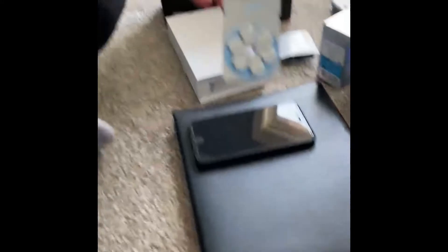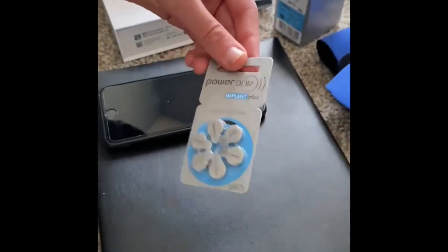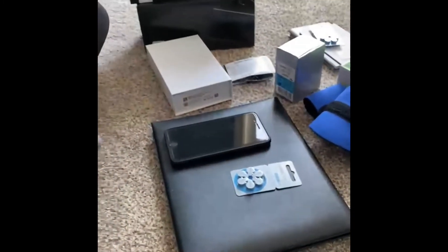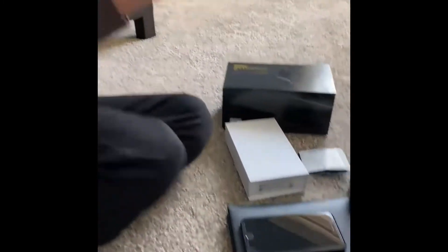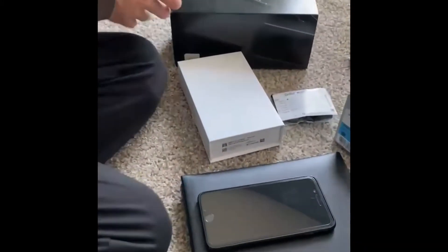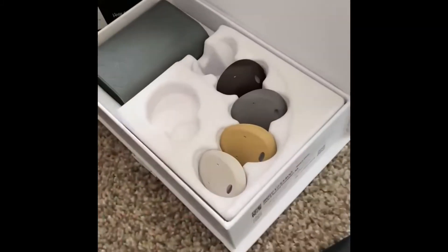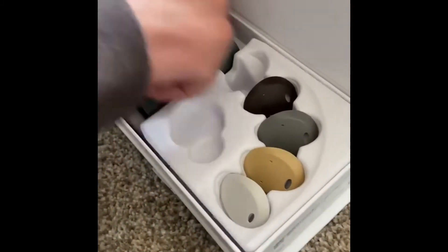These are the batteries for it, and this is the box for it, and these are the cases. This is the case right here.